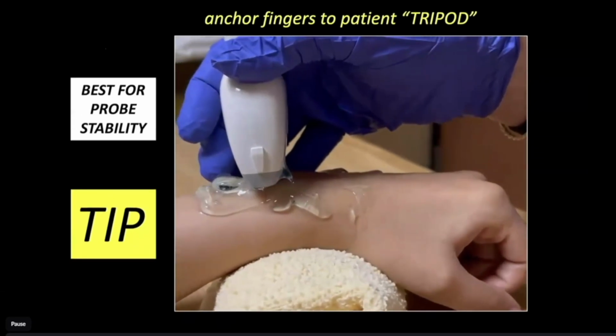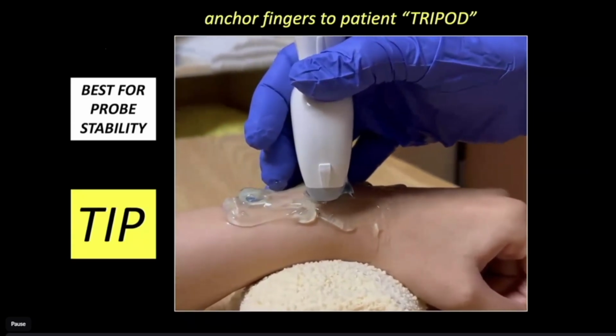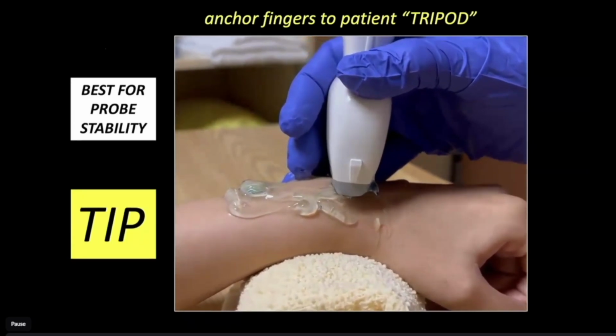This is what you're aiming for, anchoring your fingers, having kind of like a tripod hold. That's really the best for probe stability.